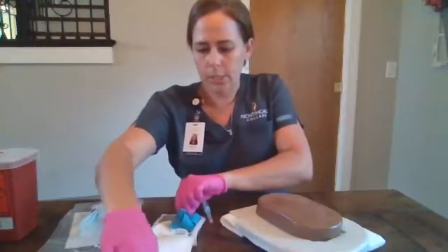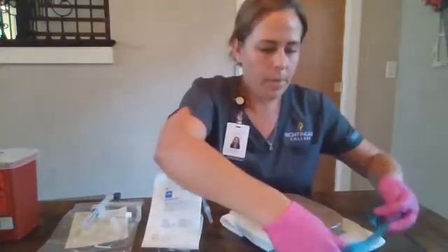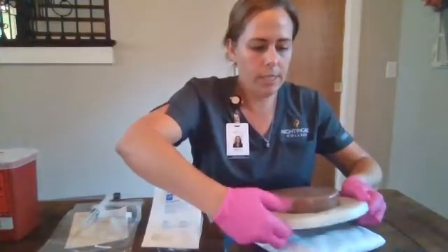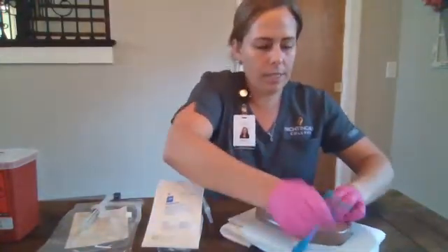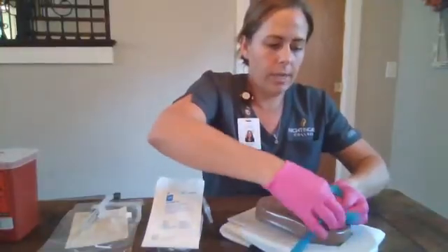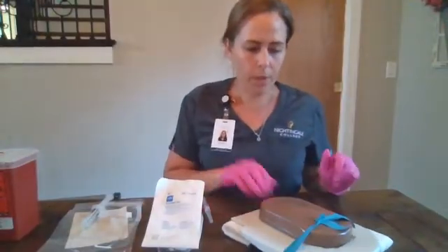I have my IV start kit. We're going to apply our tourniquet four to six inches above our anticipated IV site. We're going to ensure it's not too tight and that he still has a distal peripheral pulse.